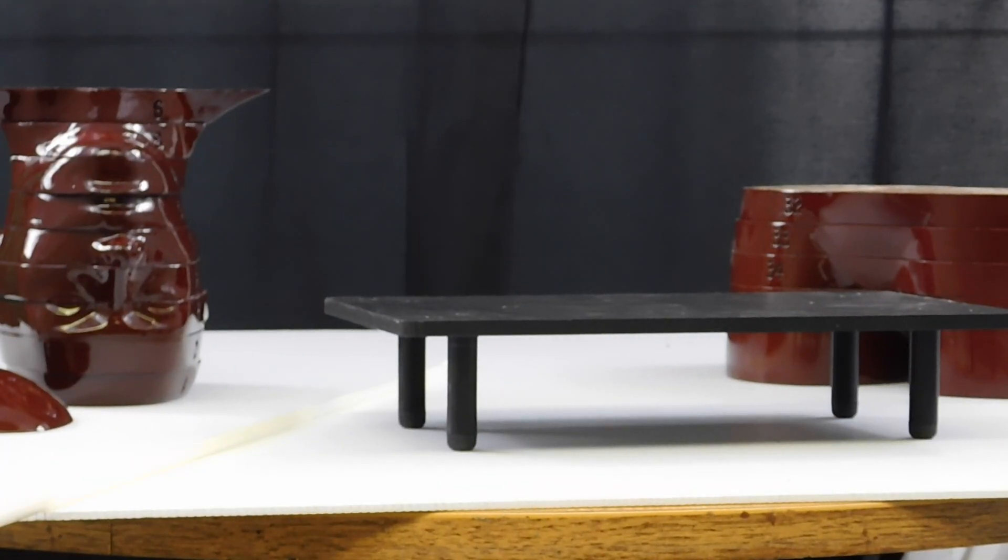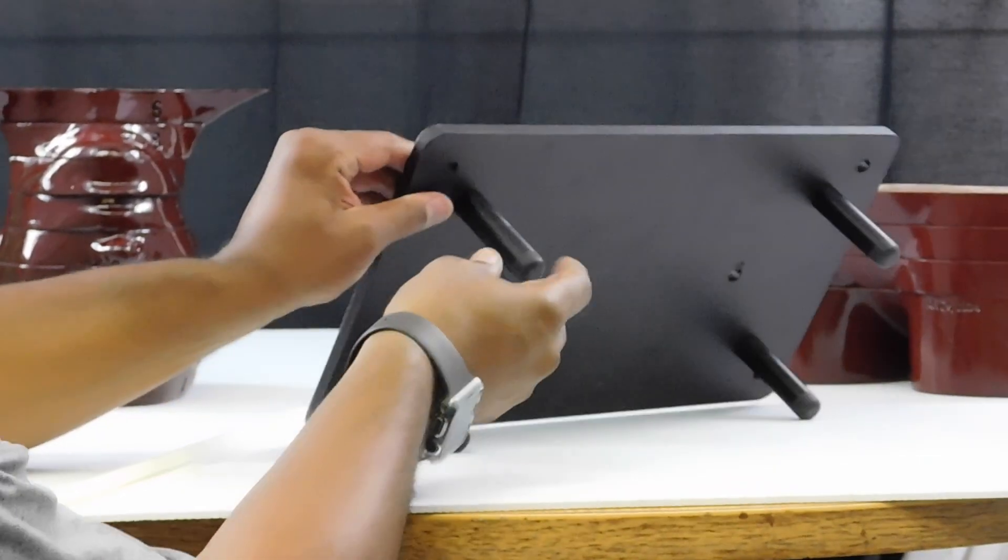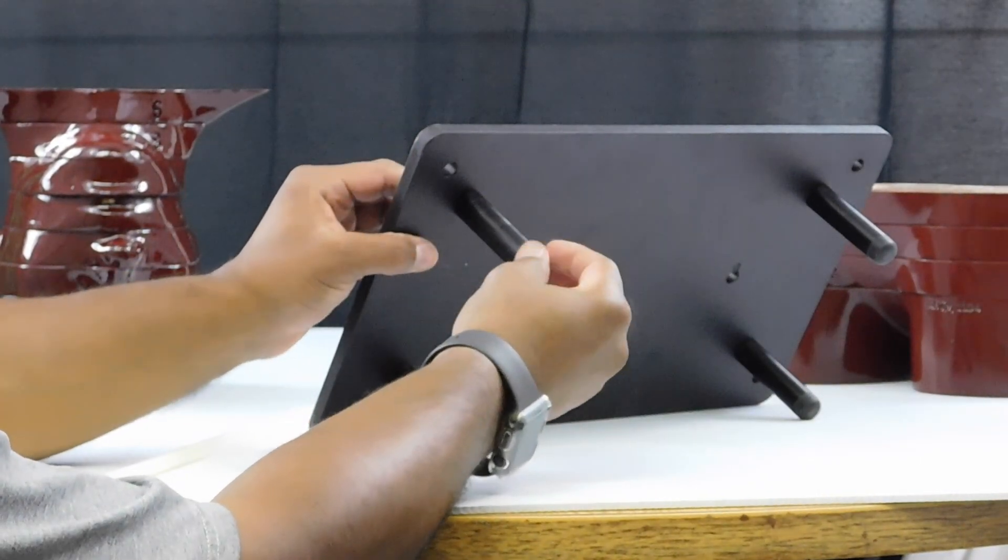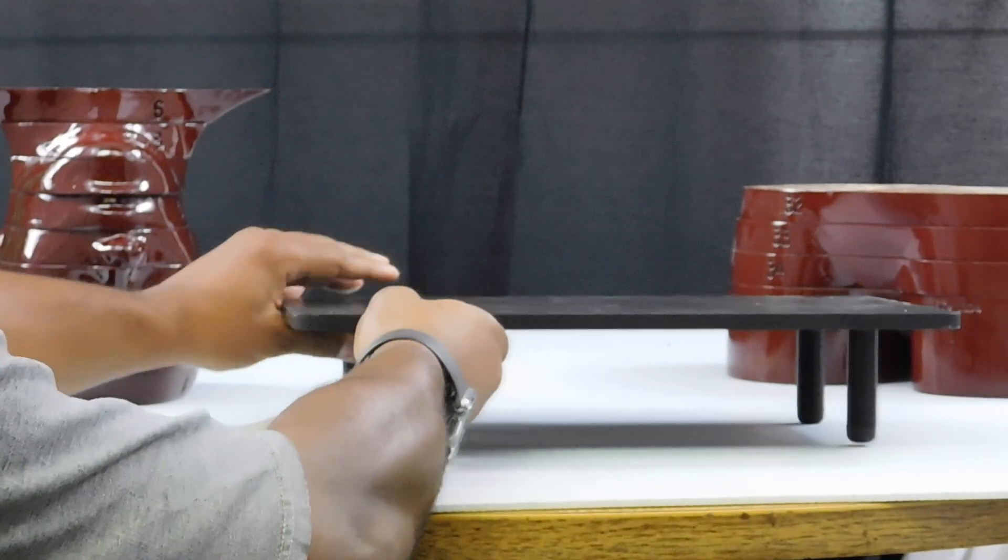To start the assembly of your ART Phantom, attach the legs to the base structure with the screws provided.